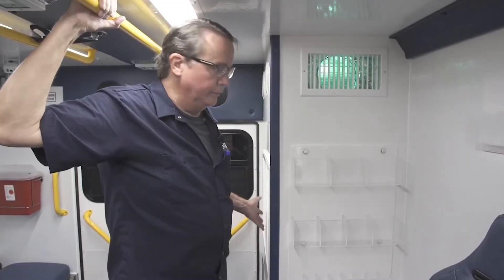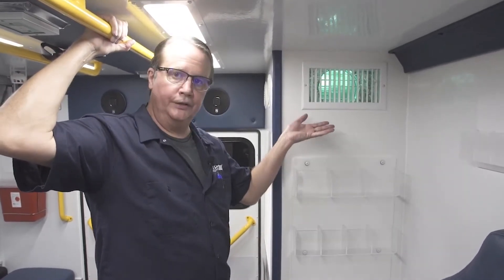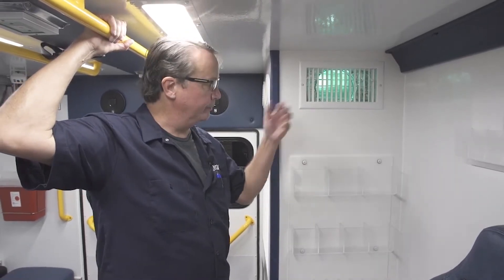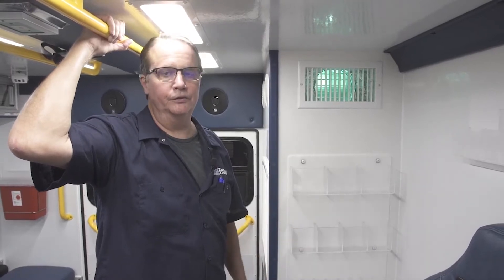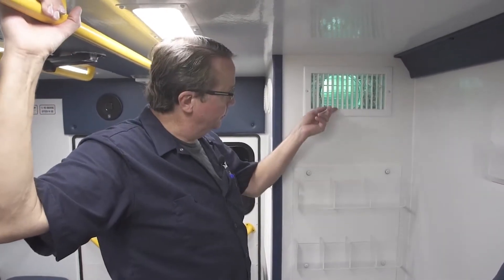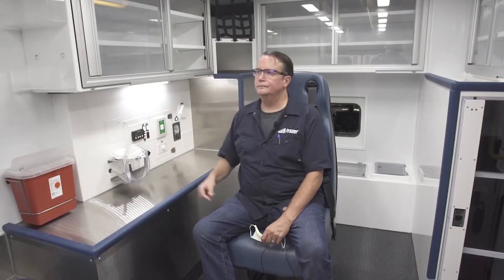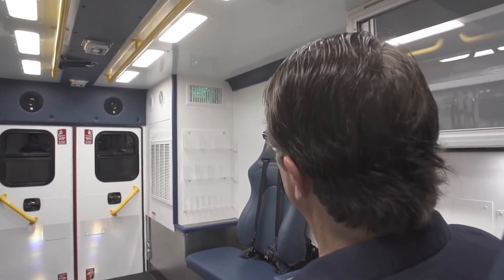Just like your filters and any other critical equipment on your ambulance, this requires a daily check to make sure it's functioning. We recommend that the lamps be changed out at least annually as part of your annual maintenance schedule. It's very easy to check — all a crew member needs to do is look up here for the glow. You can actually do that from the captain's chair. It's unmistakable and extremely easy to do.